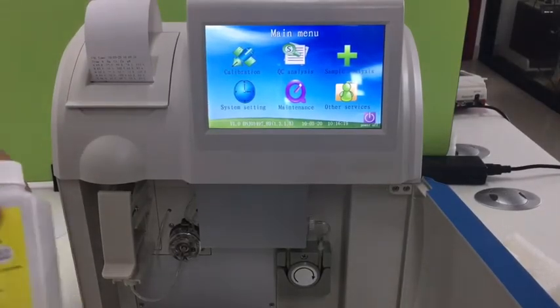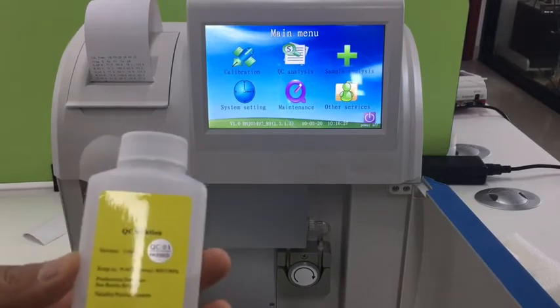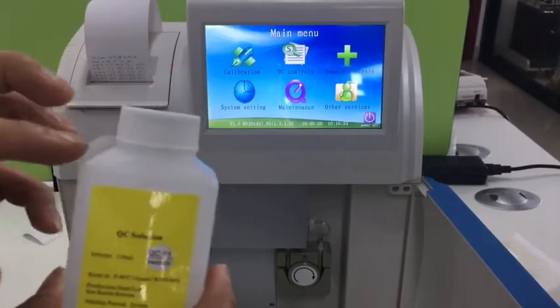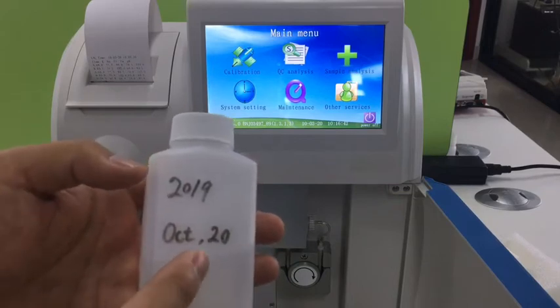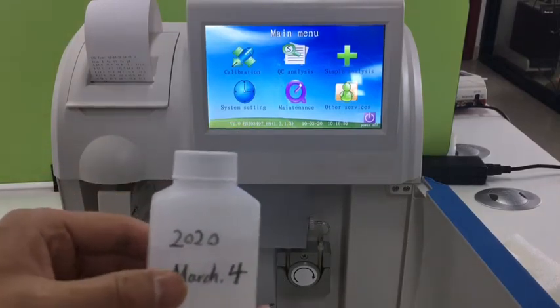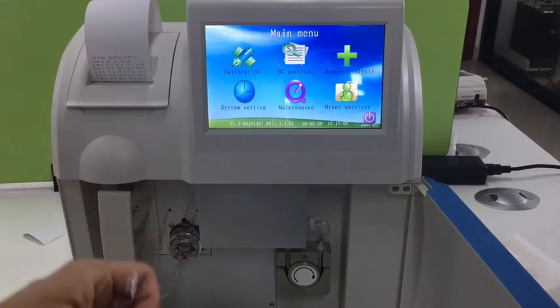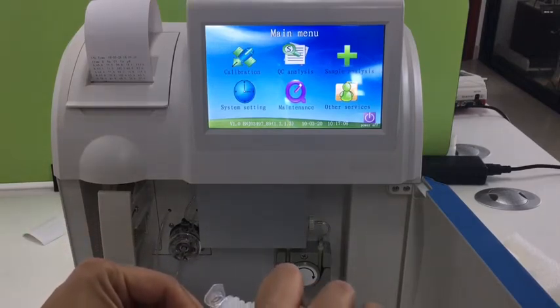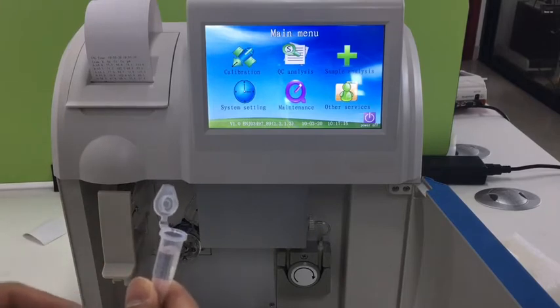Generally, we use the QC solution as a sample to do the sample analysis for demo. The warranty period of the QC solution is two years, but when opened, the warranty period is only one month. So we need to use a marker pen to note down the open date on the bottle, so it is obvious for the end user. If one is already invalid, we use another valid one. Let's take a bullet tube to take some sample first, and treat this as the human sample to do the sample analysis.